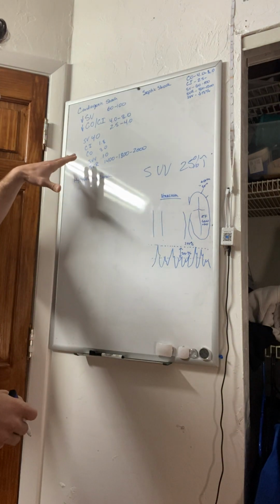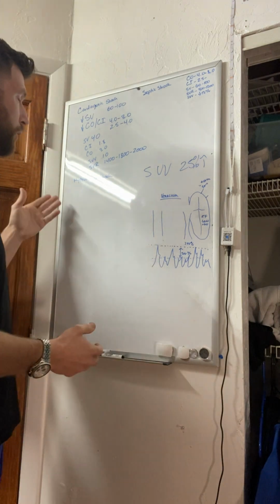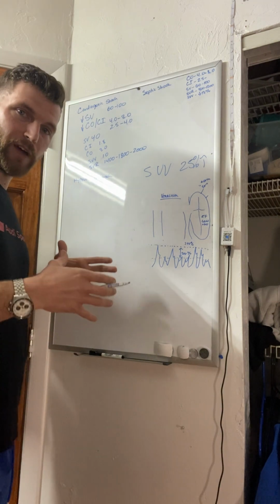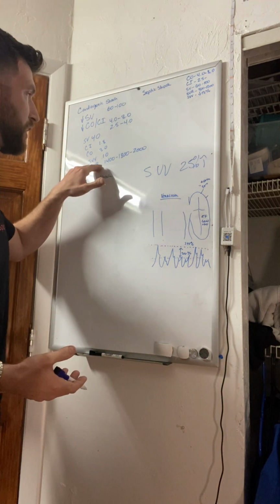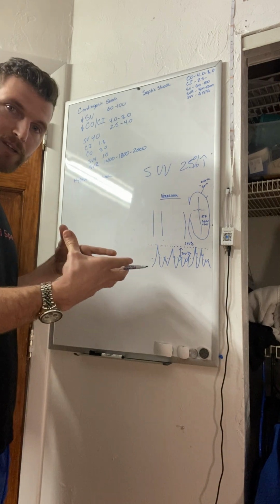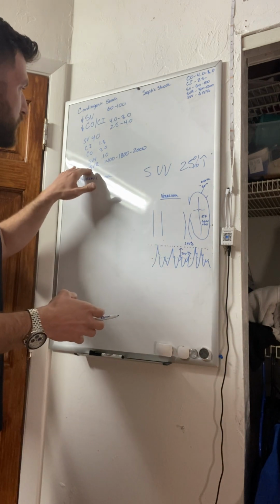So because either A, it's the equation that's causing it from the calculation, or the way I like to think about it is if the heart's not pumping adequately, the vascular system is clamping down to try to assist the heart. And so if you think about it like that, the SVR is the clamping measurement. The more clamped, the higher the number. The more relaxed the vessel is, the lower the number. So the vessels are tight, at least on the SVR monitor.